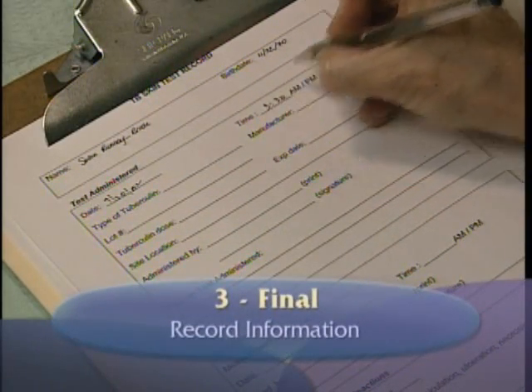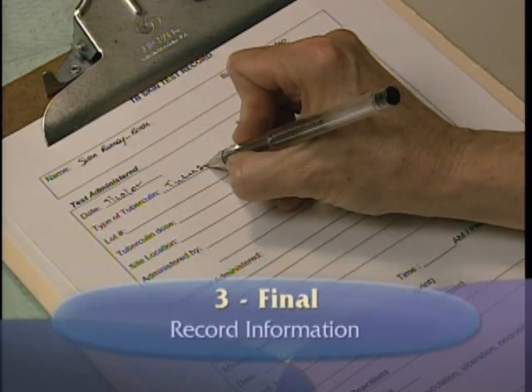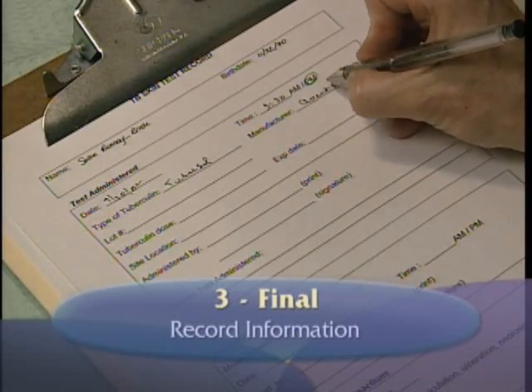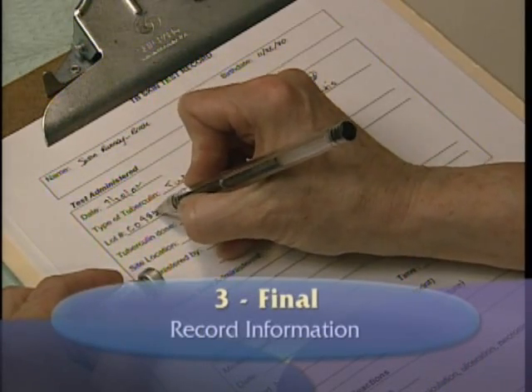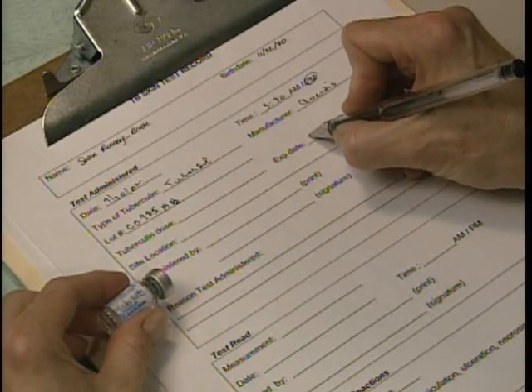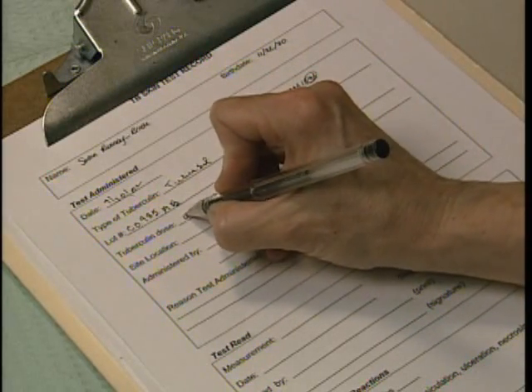Write the date and the time the test was administered, the name and manufacturer of the injected solution, the lot number, the tuberculin dose administered, the expiration date, the forearm or alternative site in which the injection was given, the site location if you repeat the test, the name of the person who administered the test, and the reason for giving the skin test.